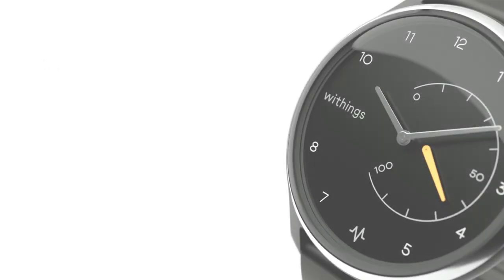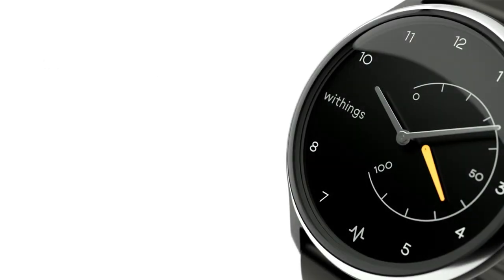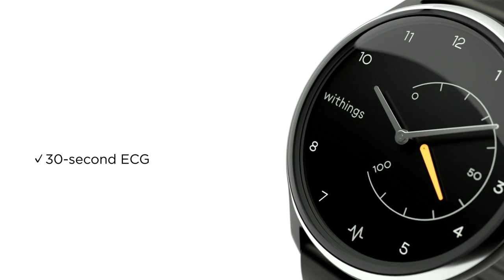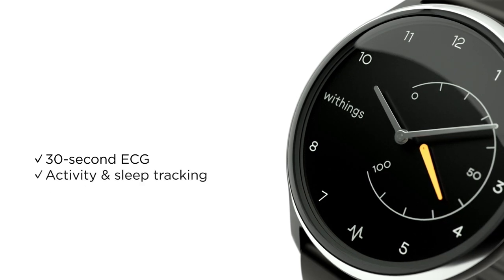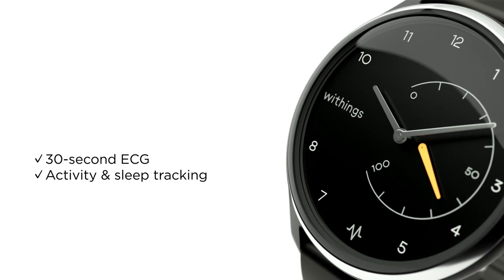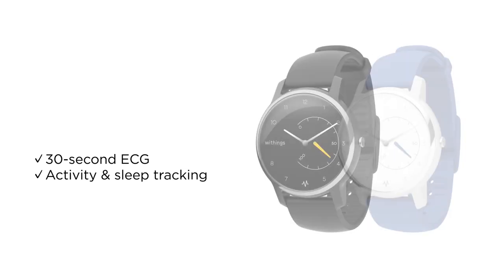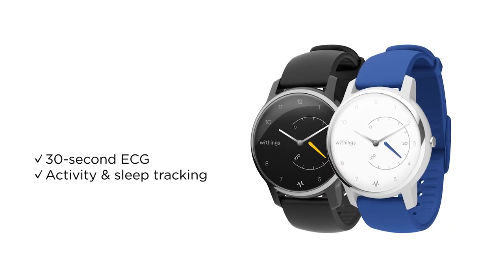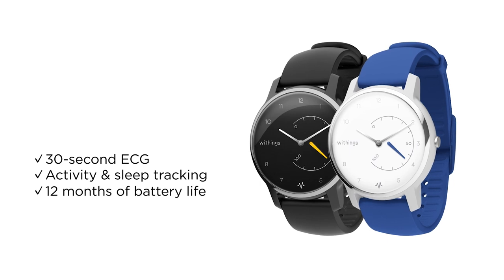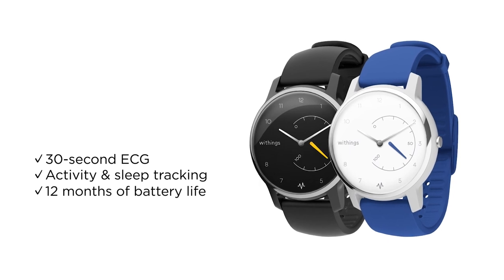Move ECG records an ECG in 30 seconds, even if you don't have your phone, automatically tracks sleep and activity, and it requires no charging. The watch operates on a simple button cell and has 12 months of battery life.